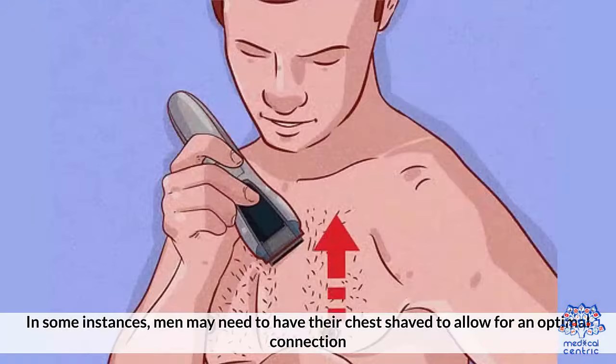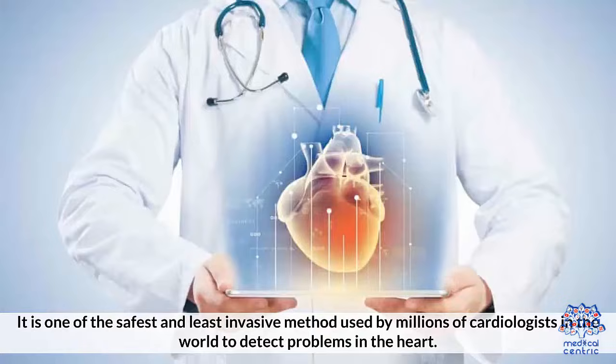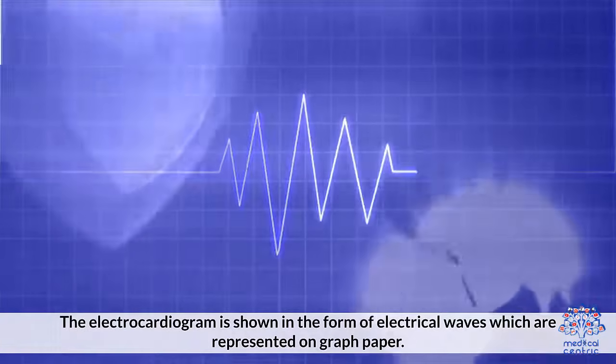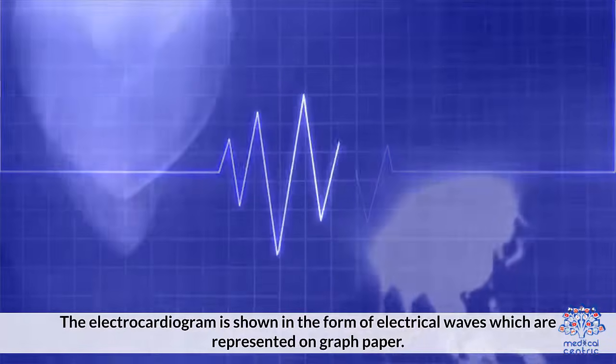In some instances, men may need to have their chest shaved to allow for optimal connection. It is one of the safest and least invasive methods used by millions of cardiologists in the world to detect problems in the heart. The electrocardiogram is shown in the form of electrical waves which are represented on graph paper.